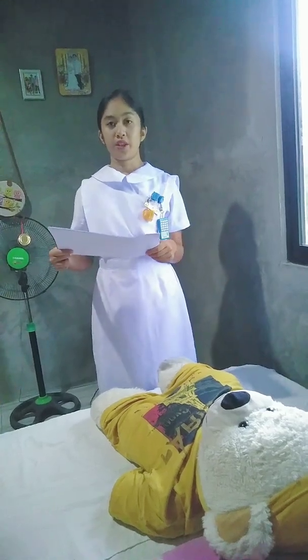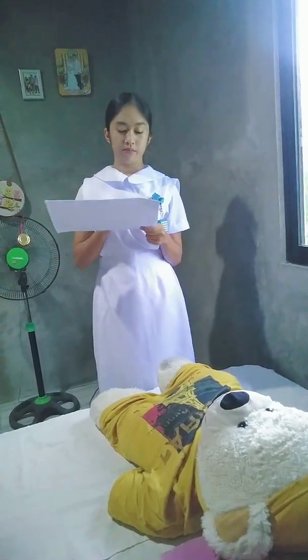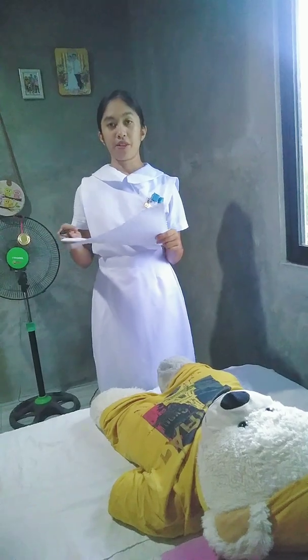For today's return demonstration, we're going to do inserting an indwelling urinary catheter for a female. Before the catheter insertion, first we're going to verify the order. Then prepare the materials needed.